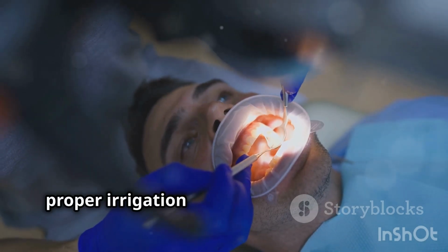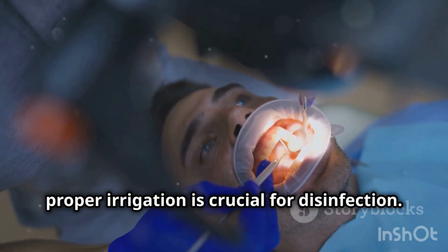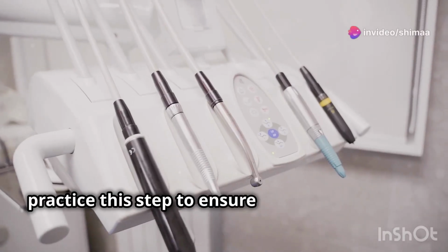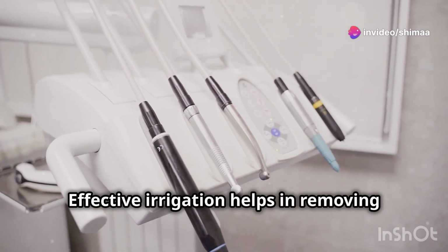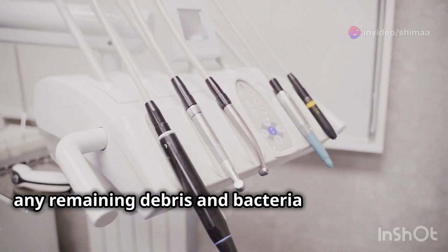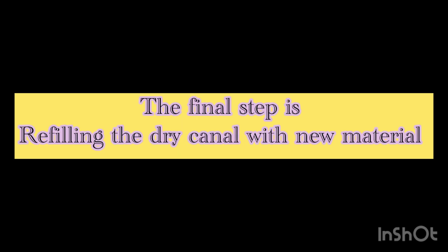Remember, proper irrigation is crucial for disinfection. Practice this step to ensure thorough cleaning. Effective irrigation helps in removing any remaining debris and bacteria from the canal. After cleaning, what's the final step?